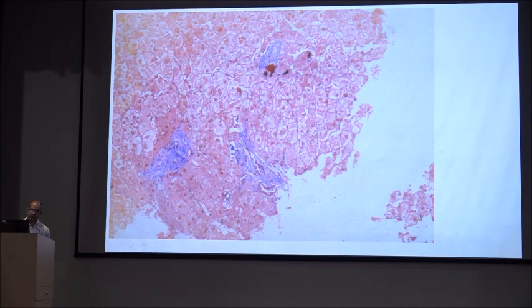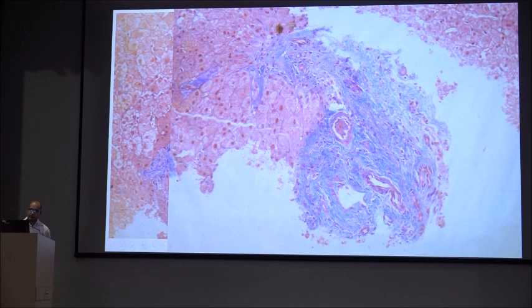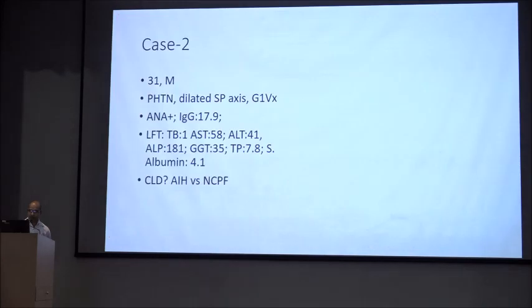These are proximate to each other, and there is no inflammation in the parenchyma, and the portal tracts are also silent. The portal veins are not visualized in these two portal tracts, whereas in this one it is an arterialized portal vein. This is a large portal tract. It is also showing two arteries, ducts, and this is a portal vein which is attenuated and showing muscularization of the wall, and that is called an arterialized portal vein. So the diagnosis in this case was obliterative portal venopathy.